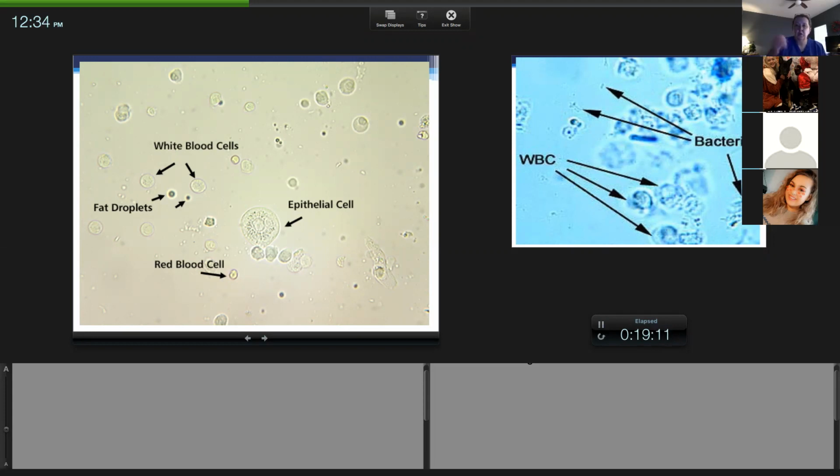Lauren, it depends. You don't expect to see yeast in the urine, and it could be a different population. Normally I don't say it's this type of yeast, I would just say I saw yeast on the urine, which you might recatch, you might get a different sample to try and confirm. But if the dog has a yeast infection and it was a free catch, then maybe during the collection the dog shed yeast. It'd be a similar population, but different than what's in the ear, we would suspect.